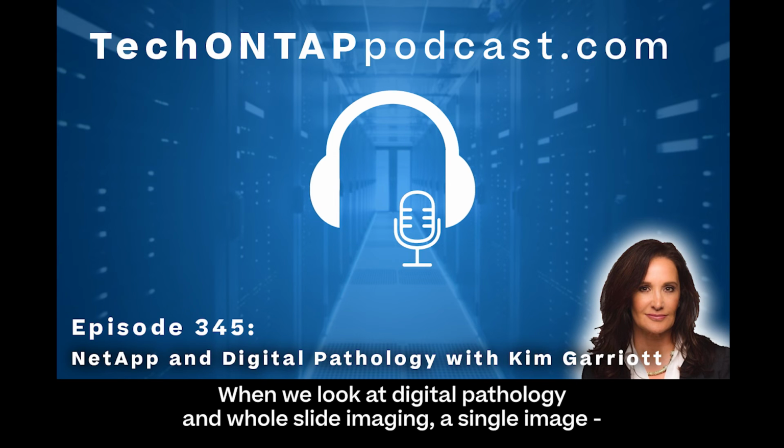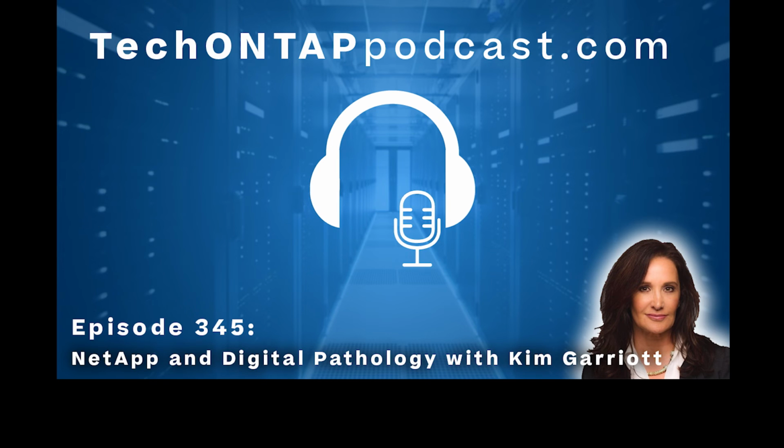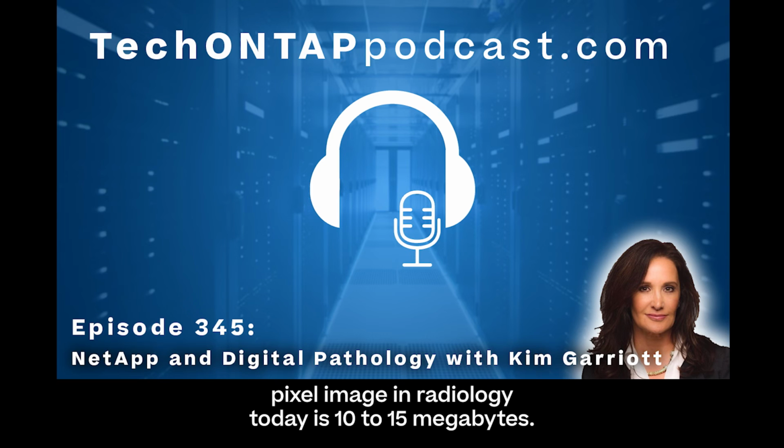When we look at digital pathology and whole slide imaging, a single image, and there will be multiple images within a single case or exam, one whole slide image is approximately 1.5 to 3 gigabytes in size. So we can see that comparison: the highest resolution, densest pixel image in radiology today is 10 to 15 megabytes.